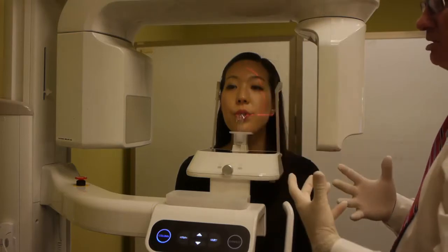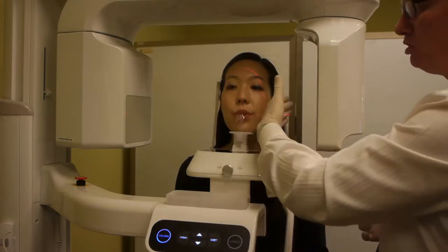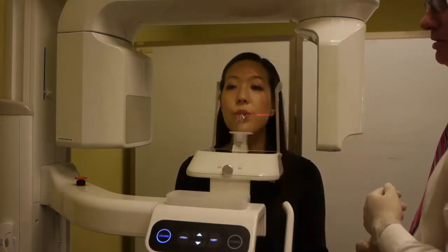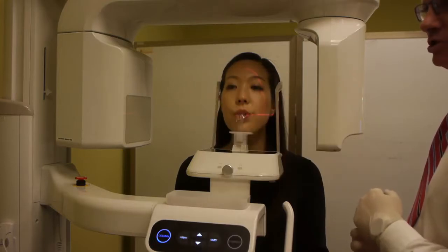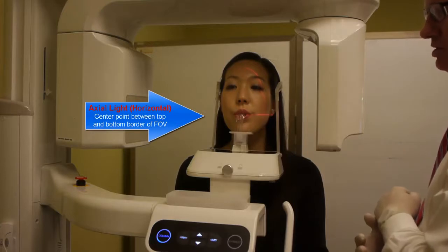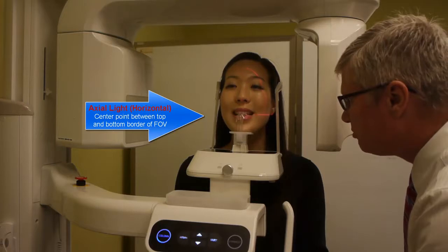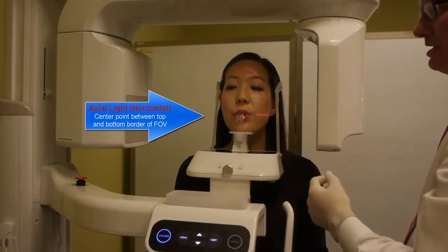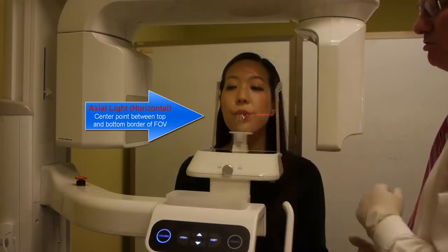So it's important to have the patient's face symmetrical in the device to capture an equal amount of anatomy, as you see here, as you would be capturing on the opposite side. From a positioning point of view, if we chose occlusal, this horizontal axial light we see here, we want this at the corner of the patient's lips, or if you would, go ahead and smile for me now, please, or right at the incisal edge right there for me as well. That tells me I'm going to capture 4 centimeters of anatomy above that light, 4 centimeters down below that light.